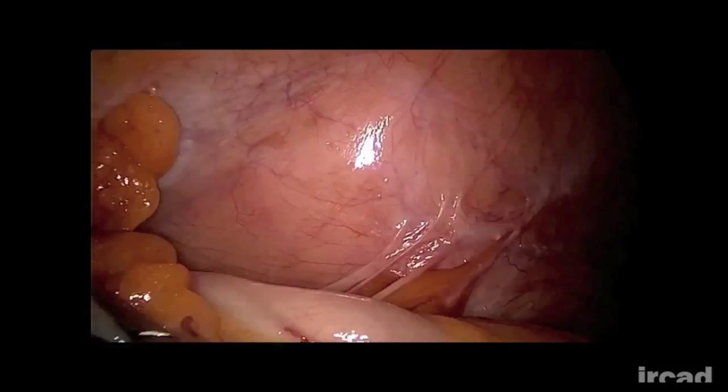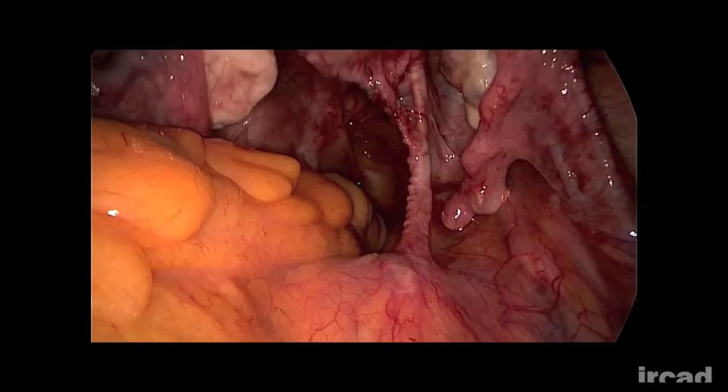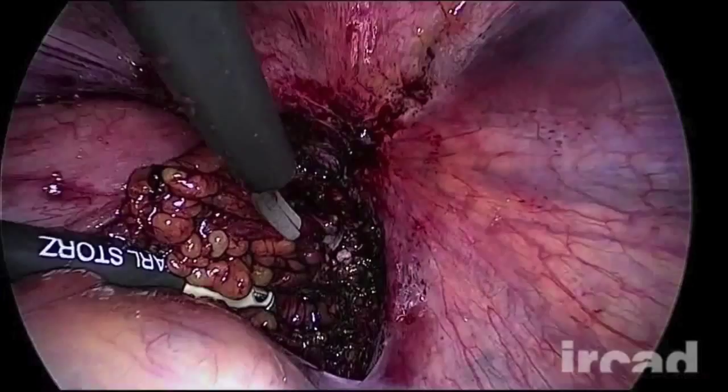This simple maneuver facilitates the exposure of the promontory and of the right side of the pelvis, where the most important part of the dissection is carried out. In this case, the recto-sigmoid is fixed laterally. The assistant's hand is blocked, pulling up the bowel, and the surgeon's movements are limited during the dissection of the pararectal fossa.